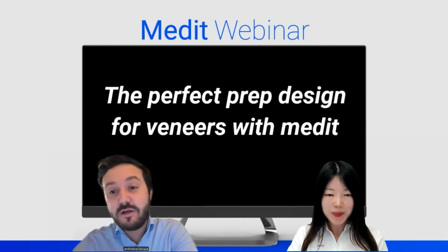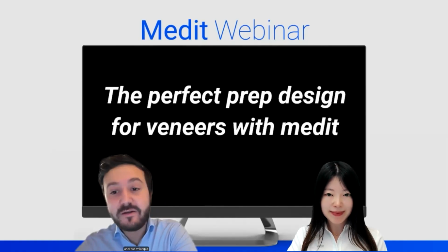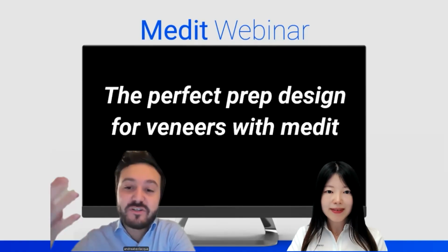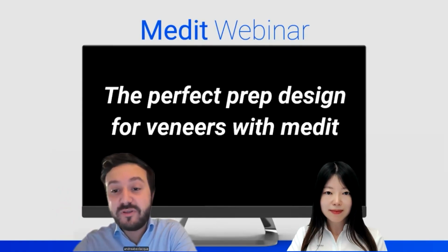Yes, because it is a concept where I create the avatar in the first visit. I have in my clinic here in Monza, in Italy, a space with the facial scan, the Medit intraoral scanner, the CBCT, and also the 3D printer.